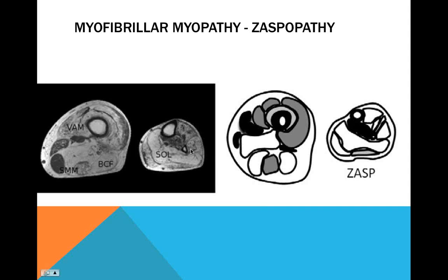But if we get the word out there, these kids have more central nervous system issues when they're born in the NICU, and oftentimes you can actually wrap them up and just papoose them and put them in the MRI, and they don't even move, right? So it would be great to actually tell people to go ahead and get MRIs on at least these NICU babies. I would think that the 1-year-olds are probably the hardest, or, you know, starting from 6 months on when they start to move a lot. But I would think it would be a really great effort to try to pick up on the changes in the muscle in this really early age group.